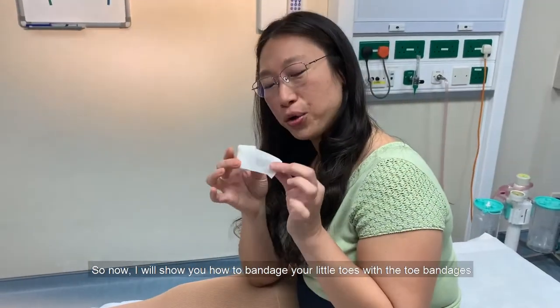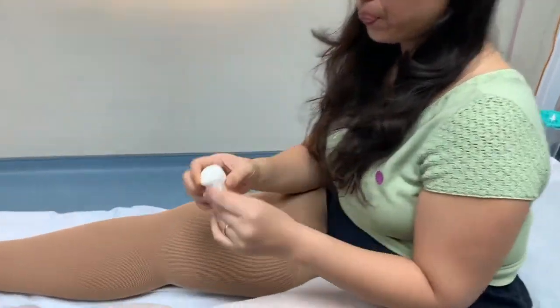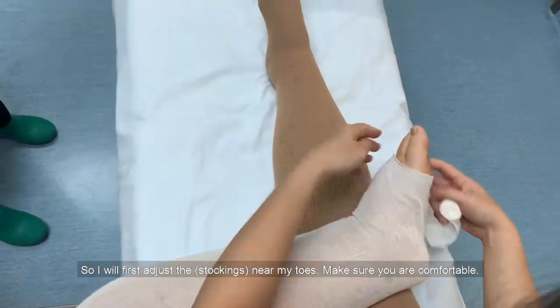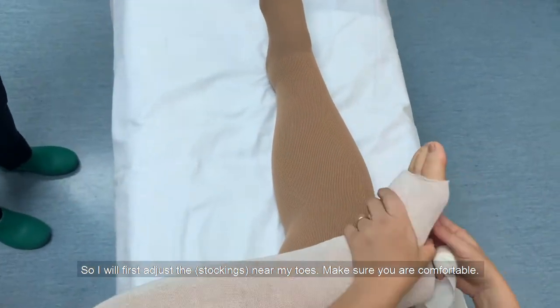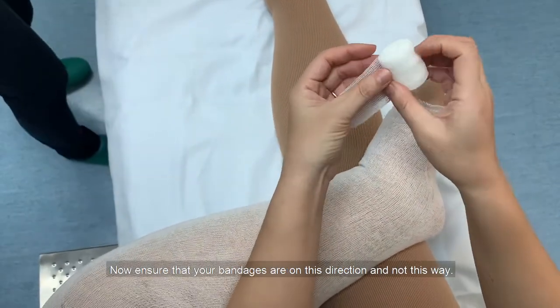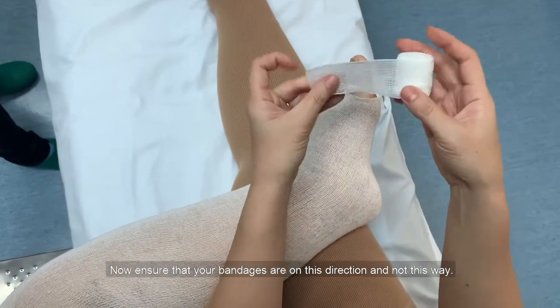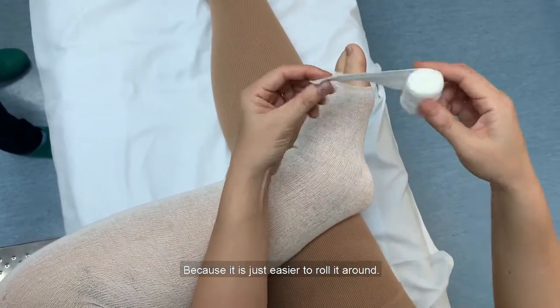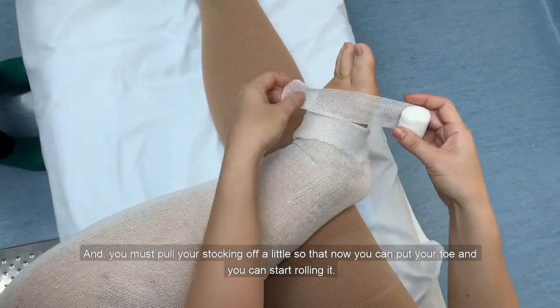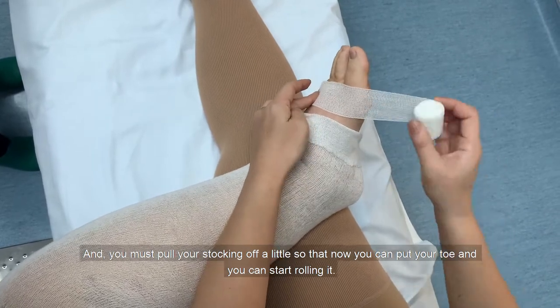I'll show you how to bandage your little toes with the toe bandages. Put your toe in and make sure you're comfortable, then start with the ends. Ensure that your bandages are oriented in this direction and not the other way because it's easier to roll around. Pull your stocking off a little so that you can place your toe and just start rolling it.